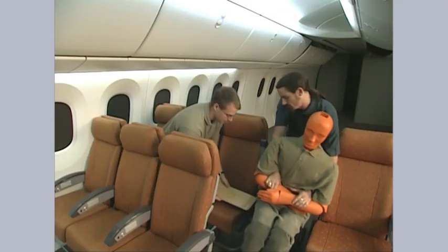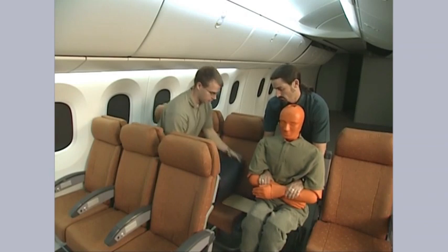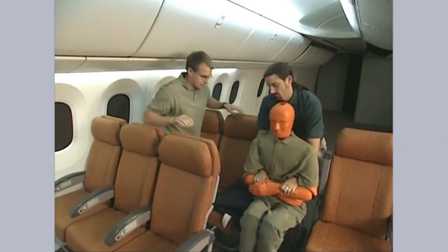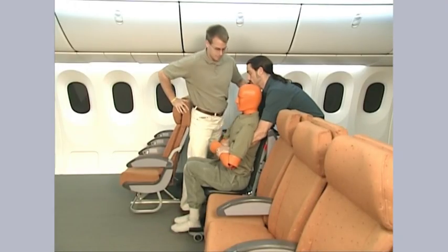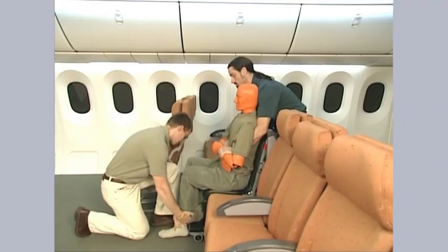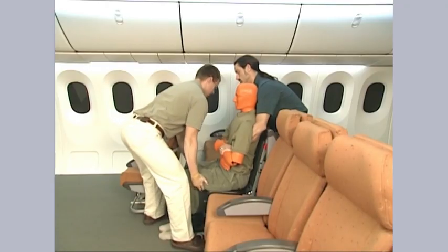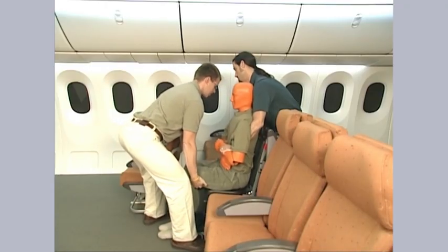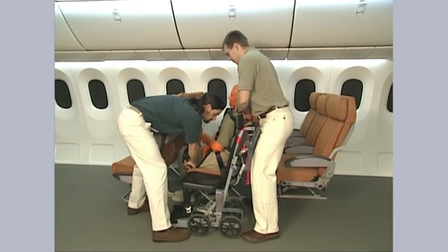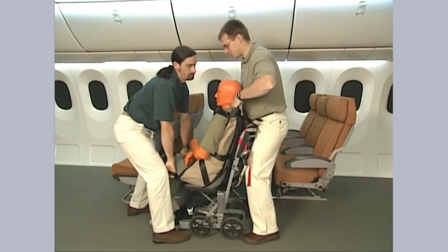We keep mentioning slings, transfer boards, or other transfer devices as good alternatives when an assist looks like more than you and your partner can handle safely. These devices allow you to use a more upright and safer lifting posture, or they eliminate the need for manual lifting altogether. Even though, for various reasons, some travelers would prefer that these devices not be used, most travelers will be open to talking about it, especially if they understand how devices like these can make your job so much safer. If transfer devices are available, think about using them when a transfer situation looks dangerous. Before you try them, though, you must get training in their proper use.